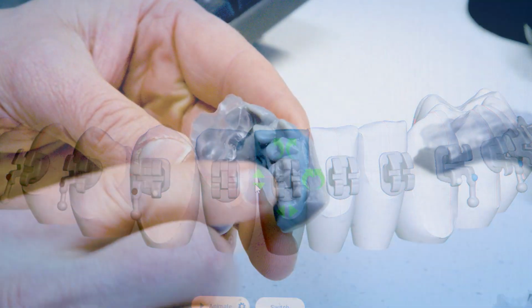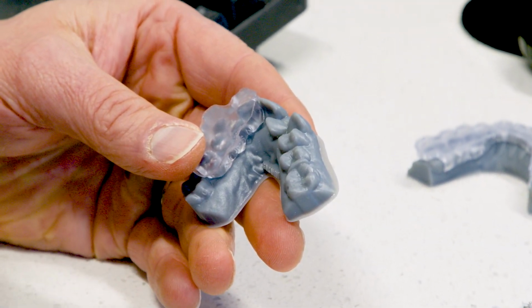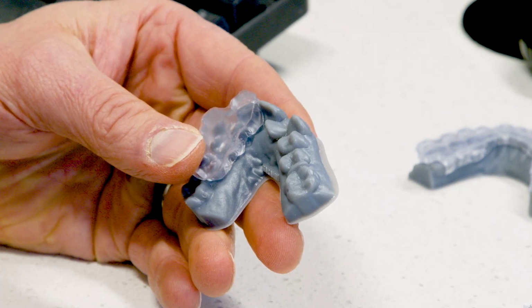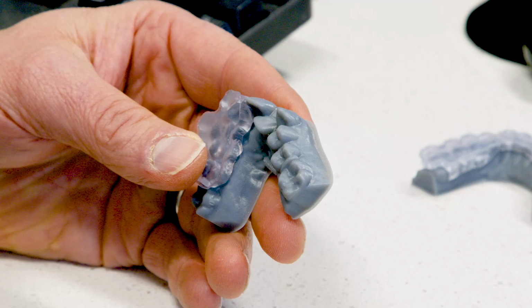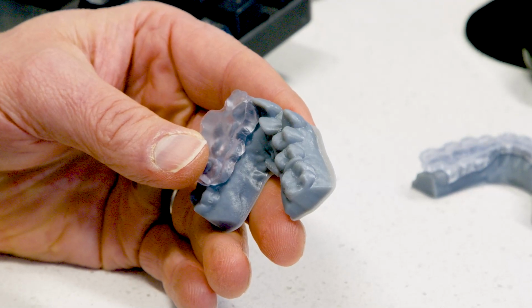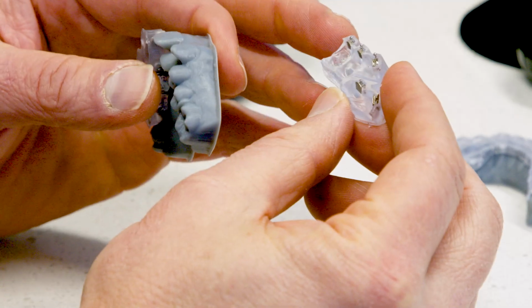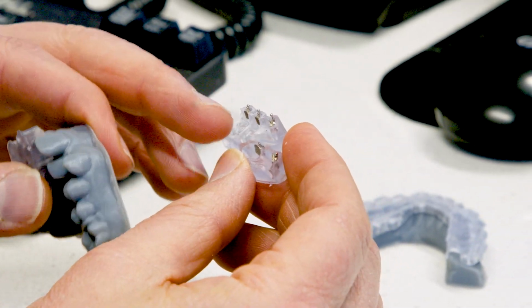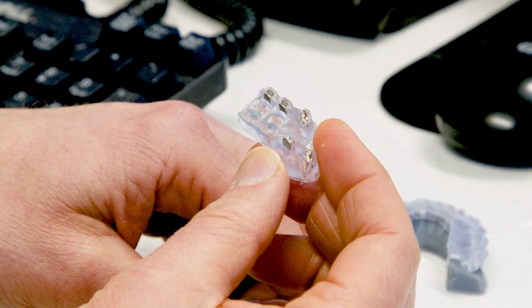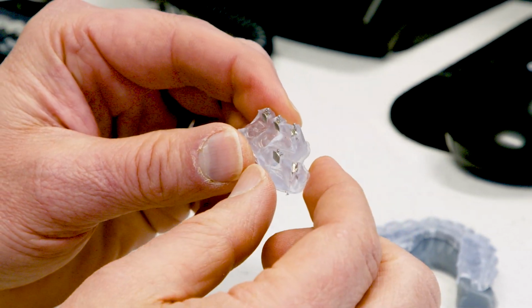This is a three-dimensional model that we have printed, 3D printed in our office from the scan that we have taken. As a result of that, we then use the technology to place the brackets exactly where we want them on the teeth. And then we generate, as a result of that, a three-dimensional stent of exactly where we want the brackets to go. So we actually then place the brackets inside this stent and then use this stent to place brackets onto the patient's teeth.